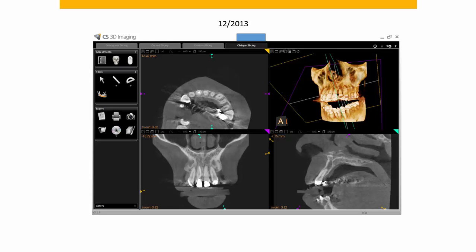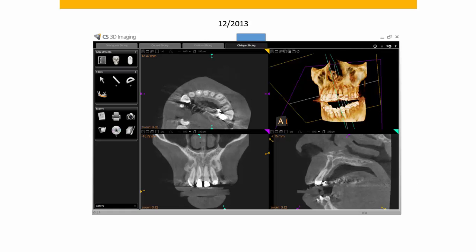We took a cone beam CT. I wanted to see if the root was centered within the alveolar process before I agreed to finish him without the extractions. And it looked pretty good. However, at that point we had not had a rectangular wire in there. There was no torque expression on the upper lateral or any of the anterior teeth up till that point.